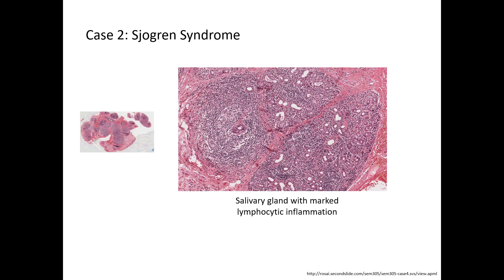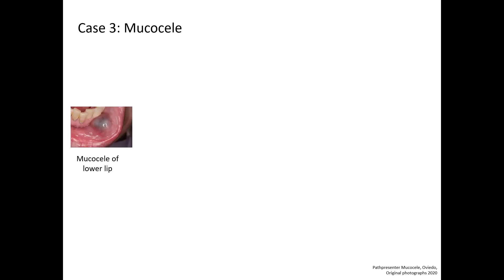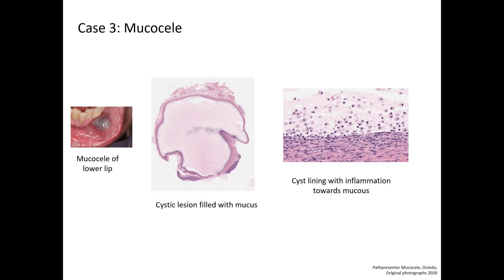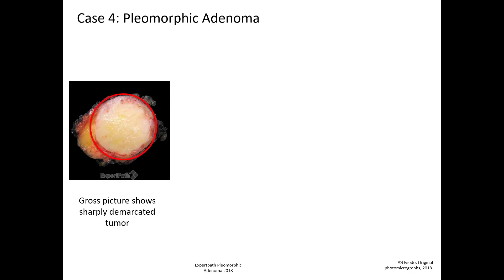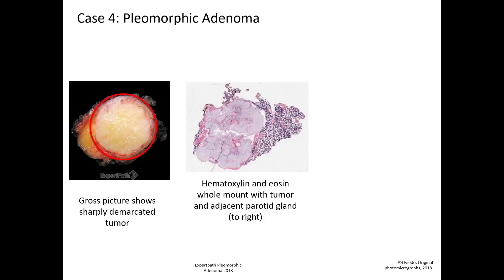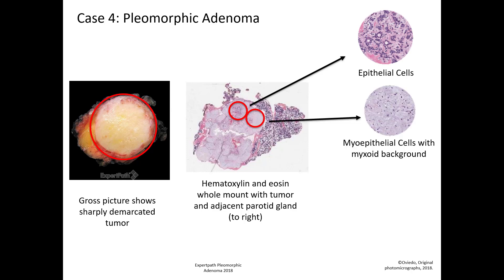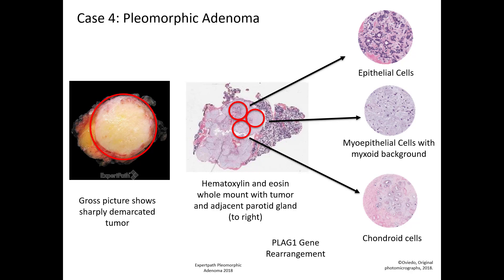Case 2 is Sjogren's syndrome — at high power, you can see the salivary gland has a marked lymphocytic inflammation. Case 3 is mucocele — on histology, there is a cystic lesion filled with mucus; high power demonstrates the cyst lined with inflammation toward the mucus. Case 4 is pleomorphic adenoma — the gross picture demonstrates a sharply demarcated tumor. The whole mount shows the tumor on the left and normal parotid gland on the right. The tumor is composed of epithelial cells, myoepithelial cells with a myxoid background, and chondroid cells. Pleomorphic adenoma generally has PLAG-1 gene rearrangement.